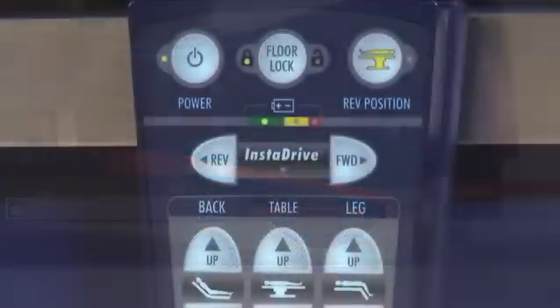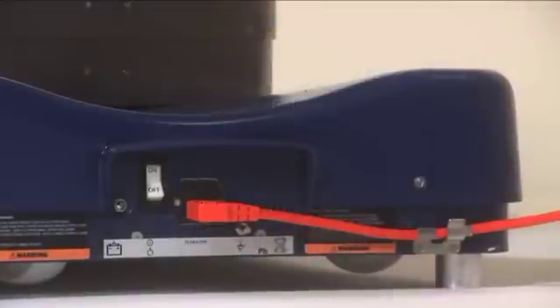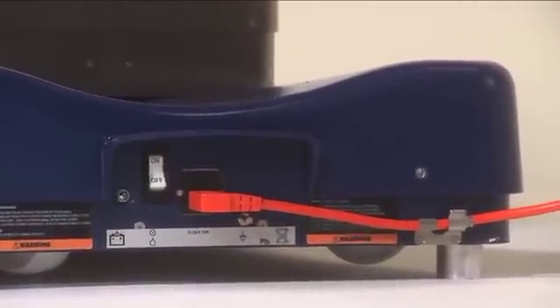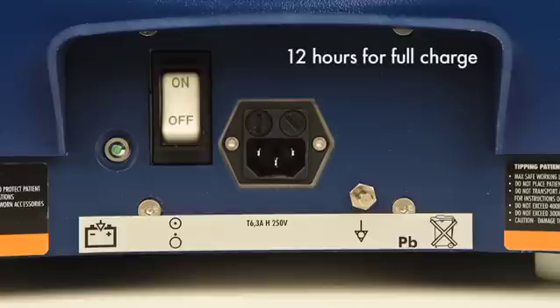There is also a Velcro strap attached to wrap and hold the cord. When the table battery is charging, the green battery indicator light will illuminate. The table can remain plugged in at all times with no damage to the table battery. The battery requires 12 hours to fully recharge.